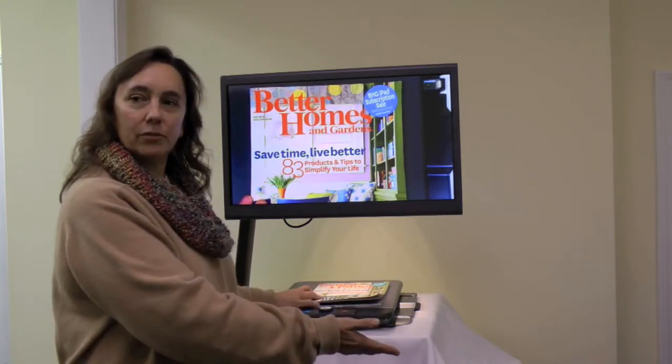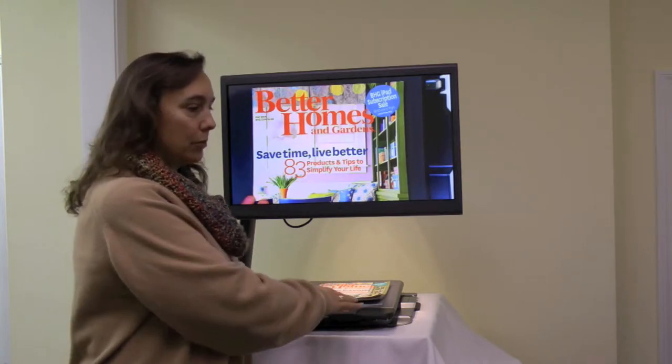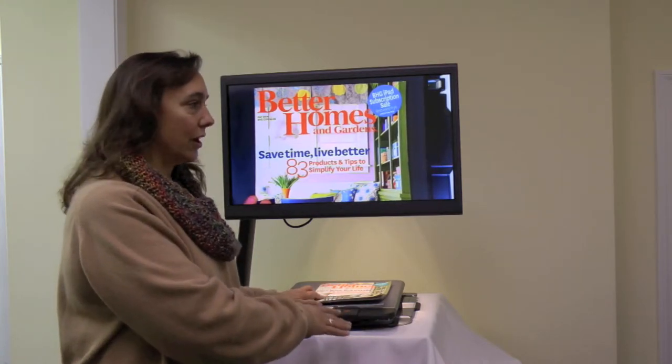You lay whatever it is you want to have read to you on the tray. The camera is shining down, ready to take a picture when you tap the screen.